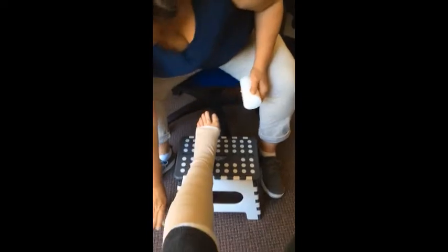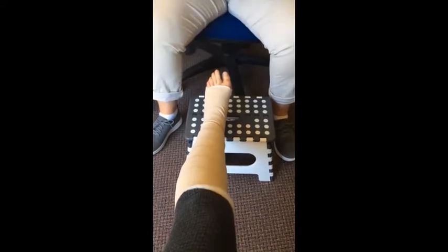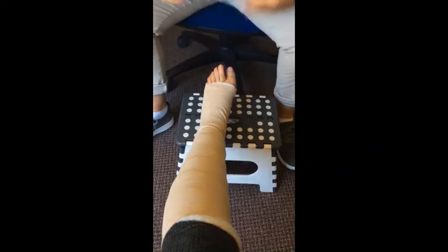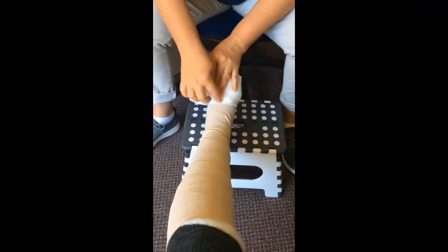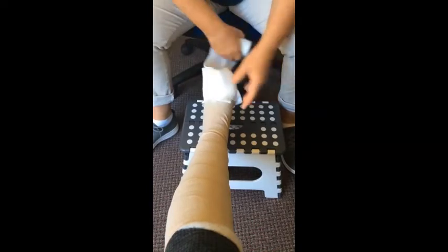The foot has already got Ksoft underneath it in this portion. What we're doing now is just applying some over the tip of the toes to protect this area. Sometimes people are a little cack-handed and you can find your own way of doing this. The essential thing is that you've got adequate protection on the tip and covered around that area. You could make yourself a little pillow by folding things over and put it over the tip of the toes and then bandage around. You want something nice and snug and you don't want to go too far up the foot — if you put the wool too far up, you haven't got enough space for the bandage to stick and the whole thing will end up falling off.